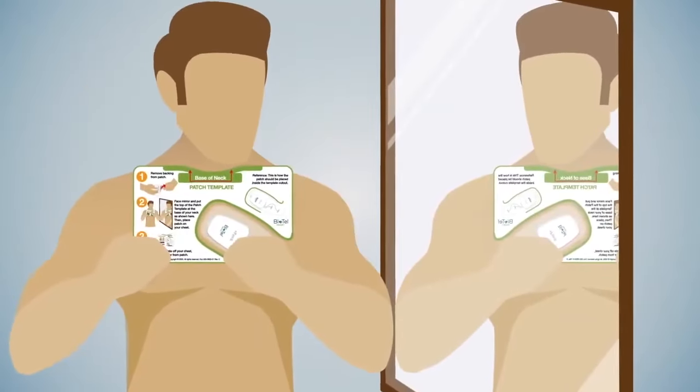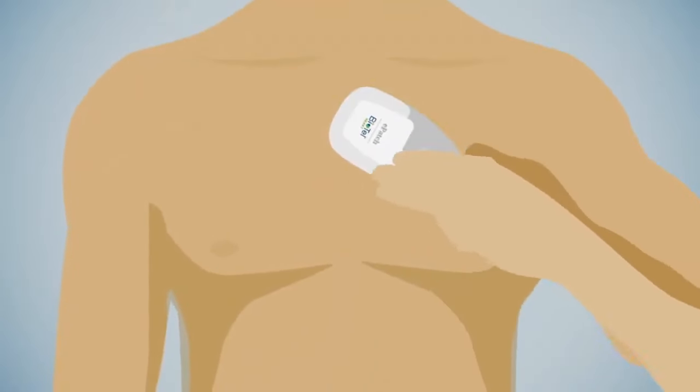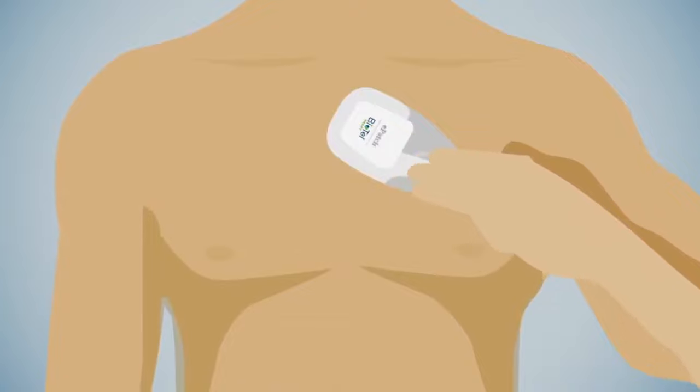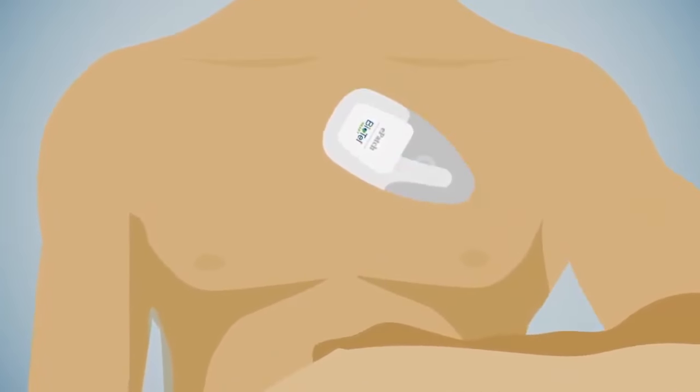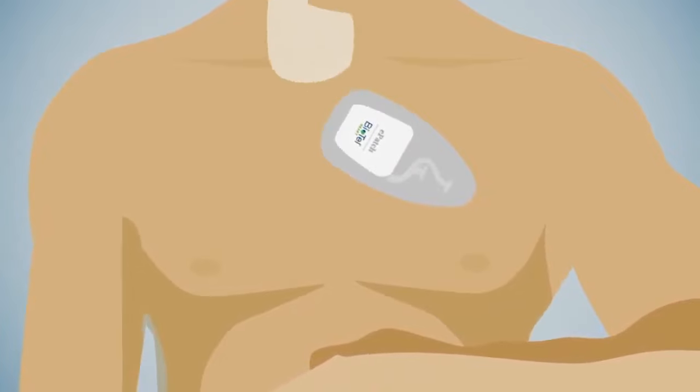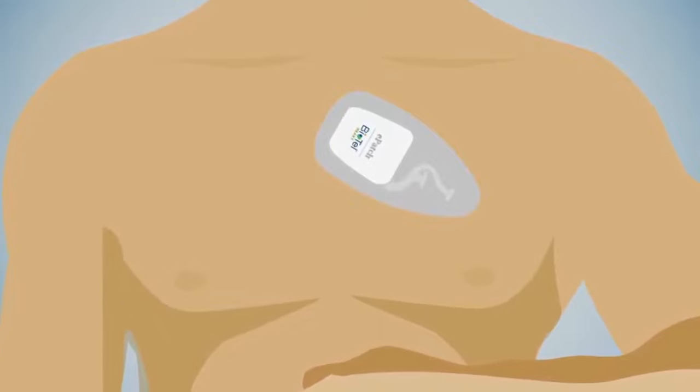Use a mirror for guidance. Remove the patch placement template when finished. Press the patch firmly against the skin, making sure there are no wrinkles. Then, remove the top white paper. This skin prep and cleaning process should be repeated every time the patch is replaced.